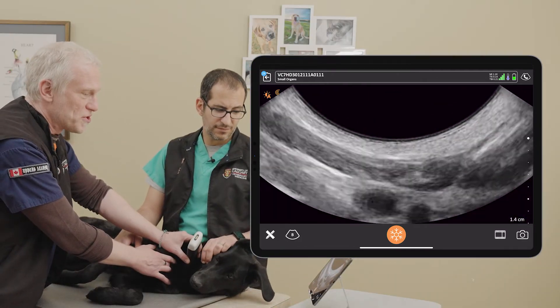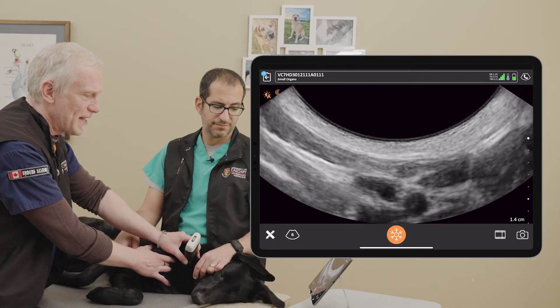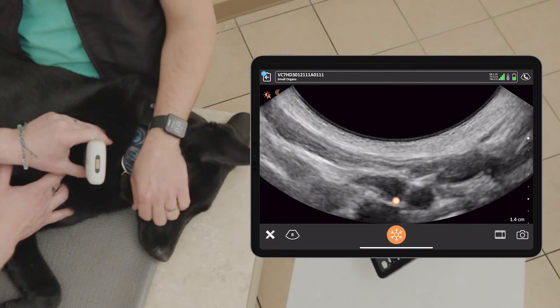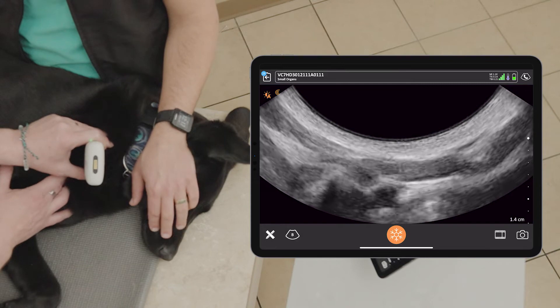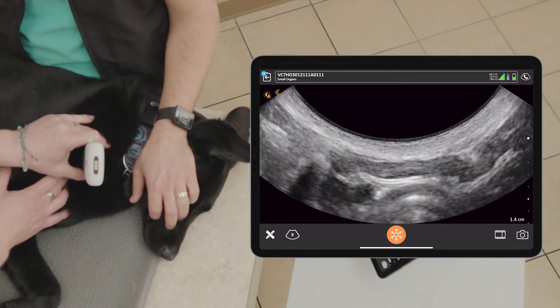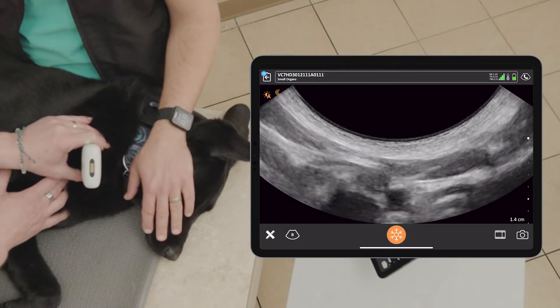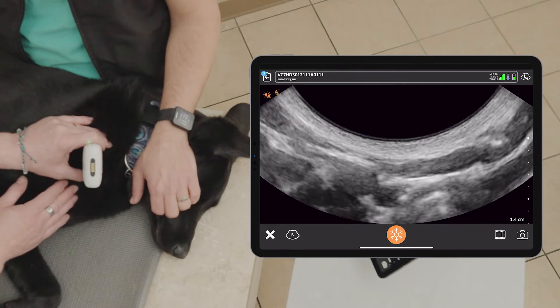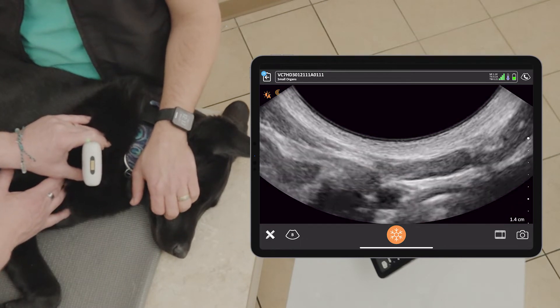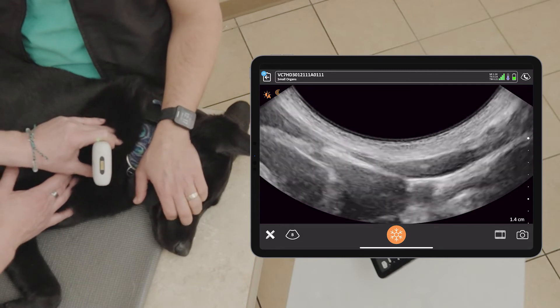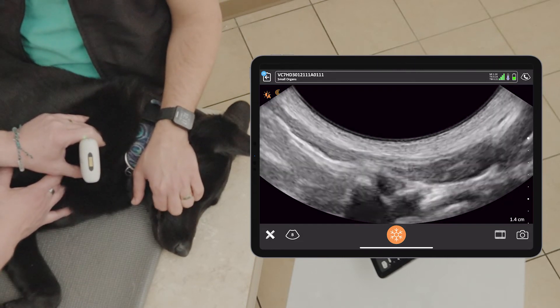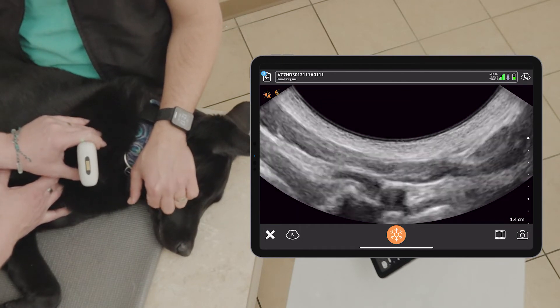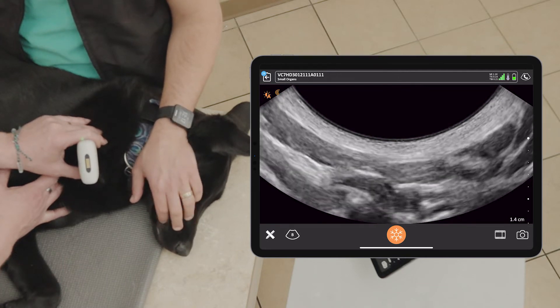We'll turn the gain up a little bit and make some adjustments to our depth setting. Here you can see I've got two vessels in short axis, Dr. Shalhoub, and I can't always tell which one's an artery and which one's a vein. If I push down on the probe I can see that I can collapse the vein — almost completely gone — whereas the carotid artery, that circular structure that's pulsing, tends to stay visible. So we can quickly assess this, look for the jugular, look for the carotid artery, and in short axis I can slide along those structures and feed a catheter into that jugular vein.